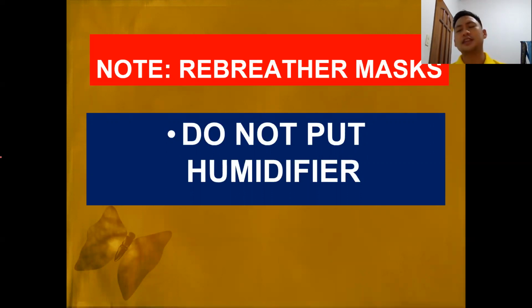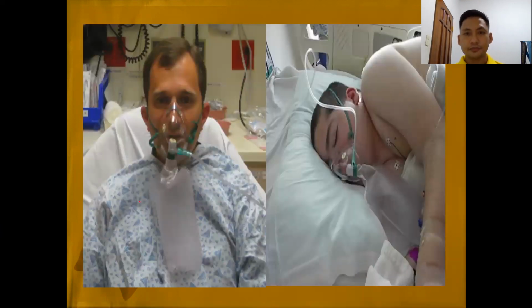So we need to assess from time to time for any improvement in the patient's condition, then we can shift to other oxygen therapy devices. Do not put a humidifier because of the very high flow rate, which could cause moisture in the reservoir bag or in the oxygen tubing.